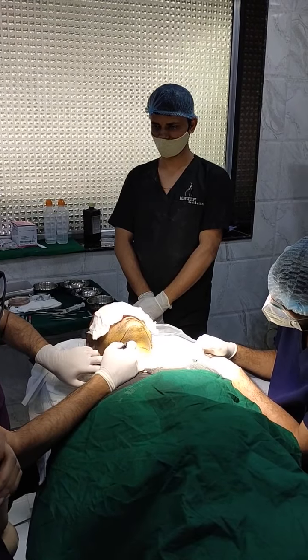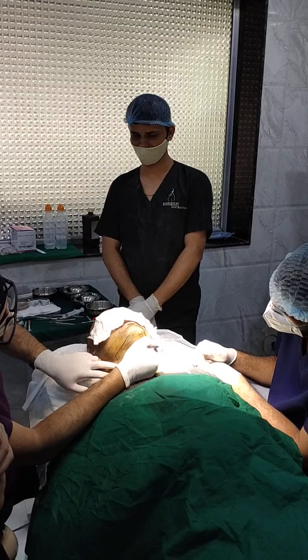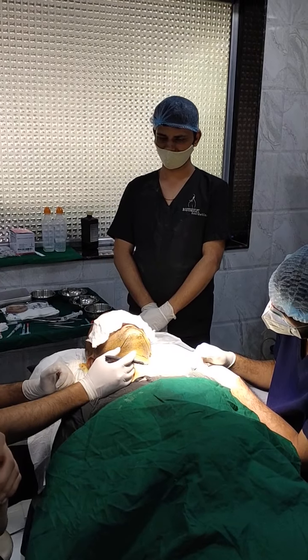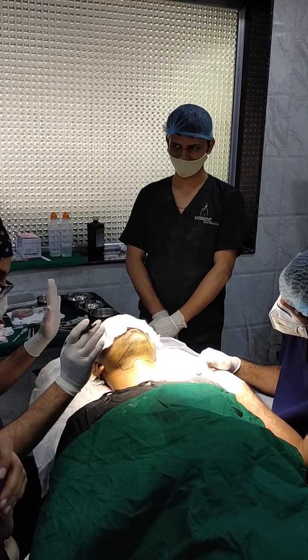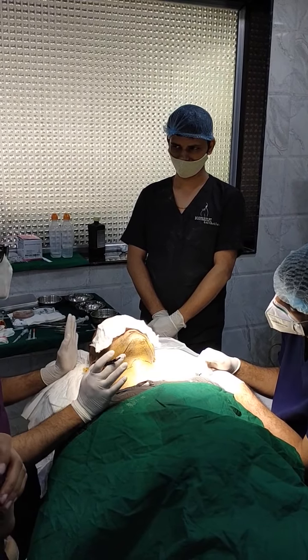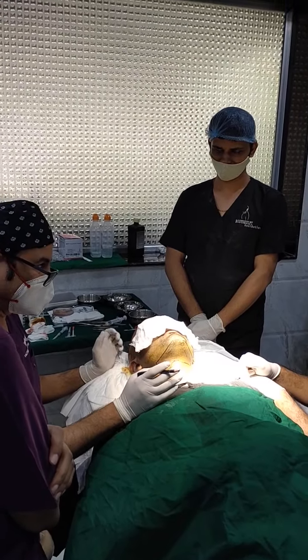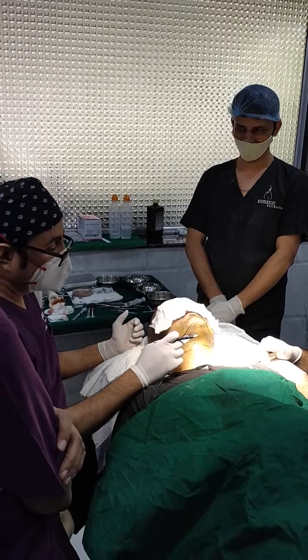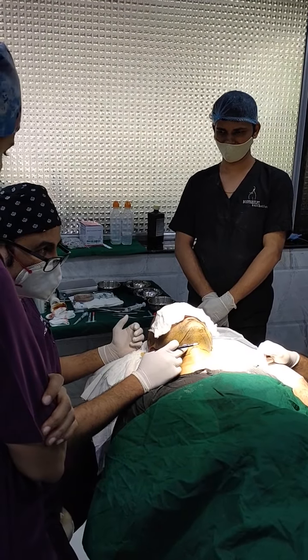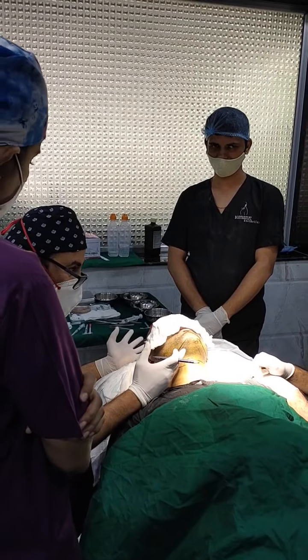What I will show you now is how to anesthetize this whole area. All we have to do is infiltrate into this area, stay subcutaneous, nothing beyond it, just below the dermis. And we are done. The patient is good enough to go, and then we will be extracting. We will be using a 0.9 mm punch, good enough. The advantage is that the follicular units are very good. It gives very good density, and you can always combine it.